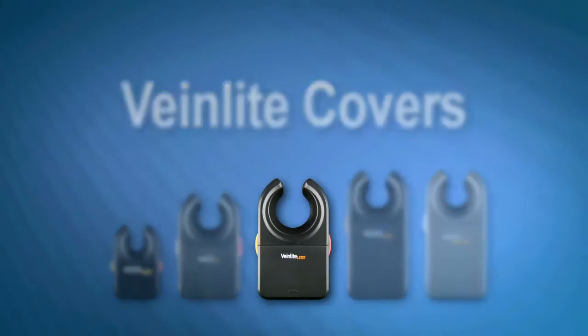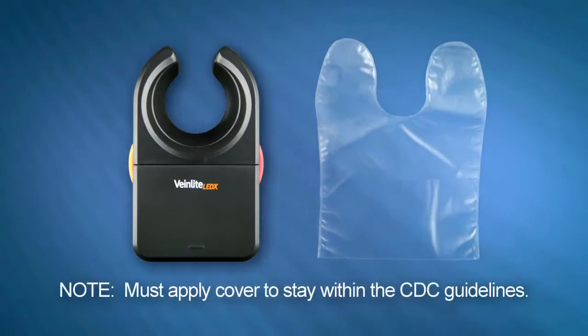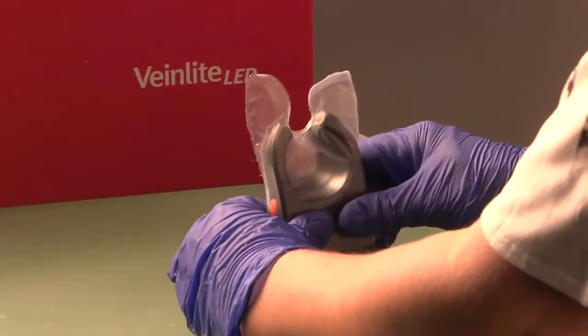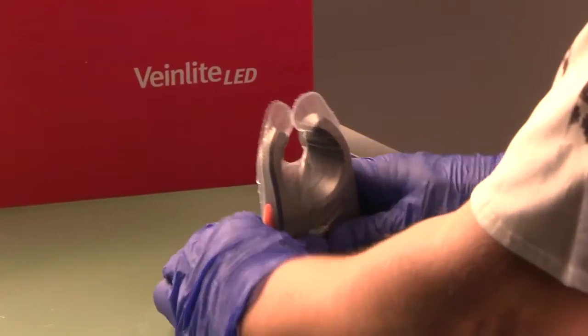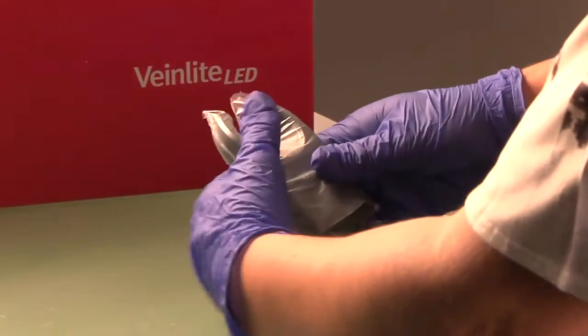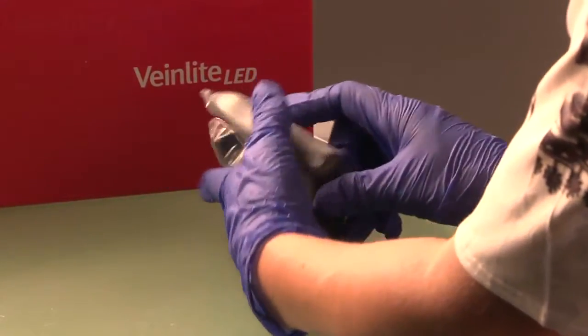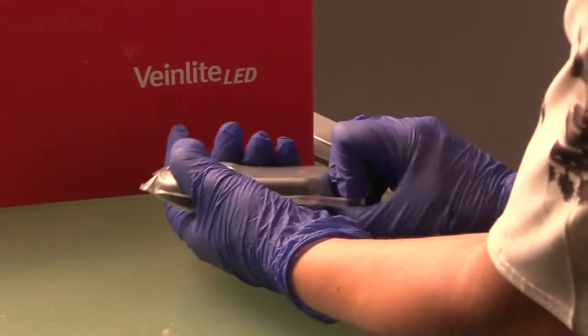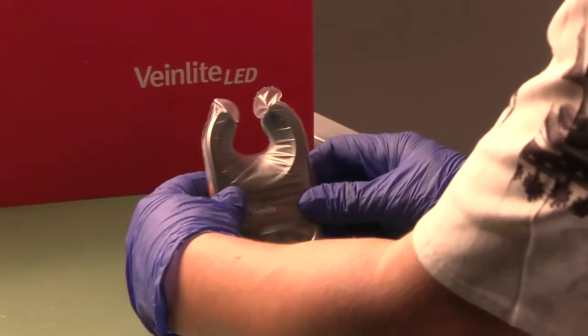Before using your VeinLight, a disposable plastic cover must be applied to prevent contamination from body fluids or cross-contamination between patients. To apply the cover, simply pull the cover with the fold-over flap oriented on the underside of the device, snugly onto the device and pull the fold-over flap up and over the battery compartment. Your VeinLight should now be fully covered and ready for use.